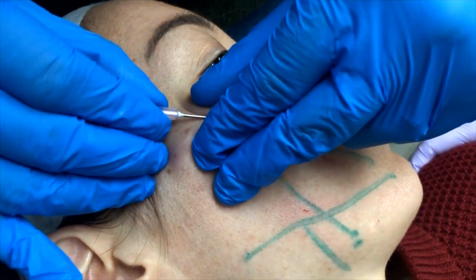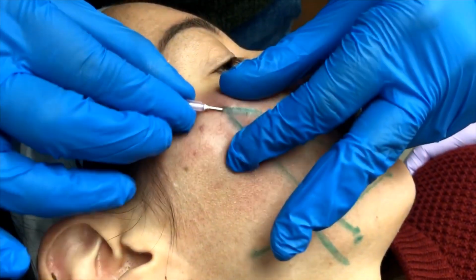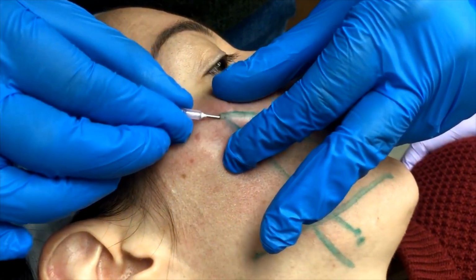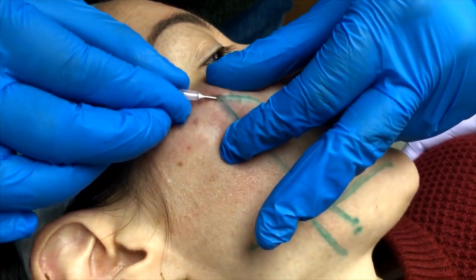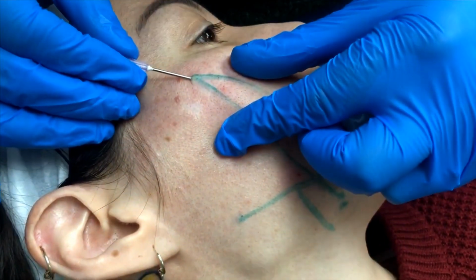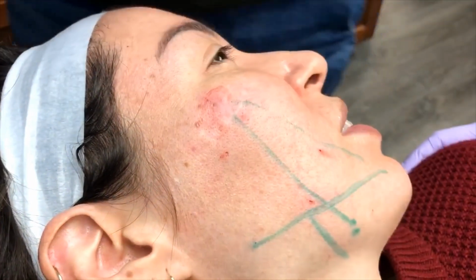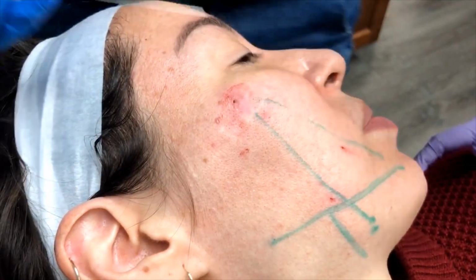This is important. Everything is going to be about the right plane. And here we are placing the pilot hole needle. We're going to use a 19 gauge thread. So an 18 gauge pilot hole needle, just going to move it side to side, open it up just a little bit, as you can see. But this is first putting us in that right plane. So that's exactly what is going to happen.